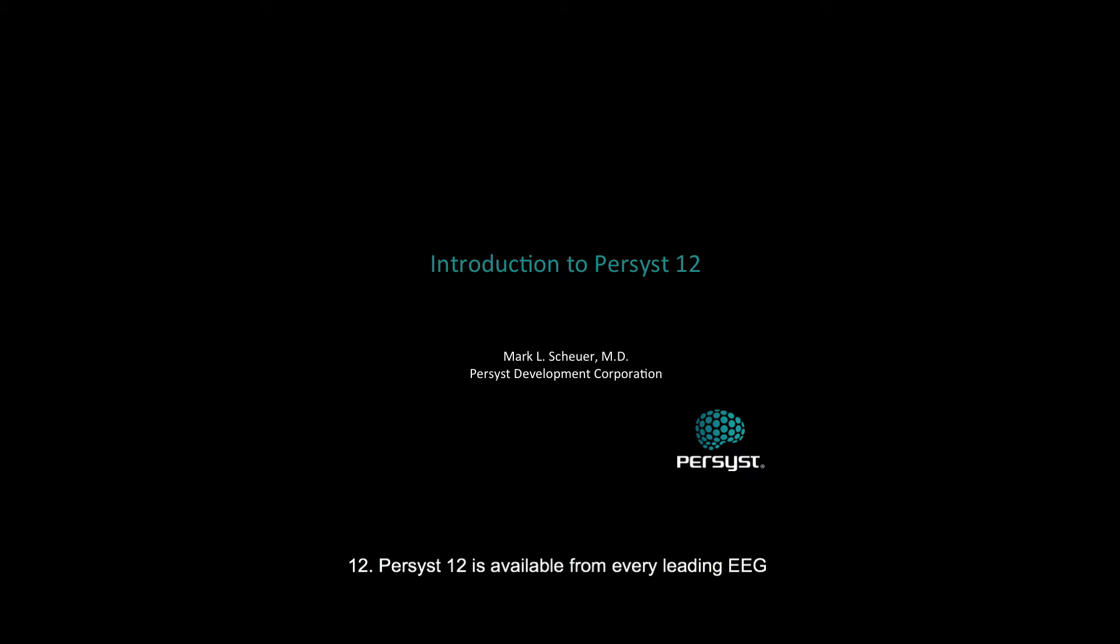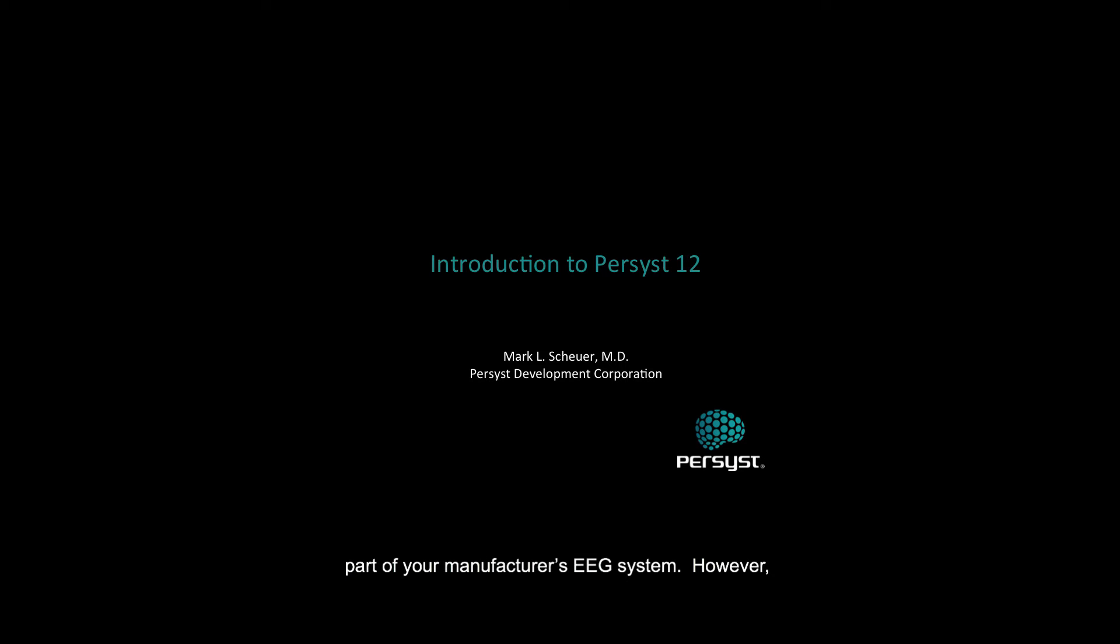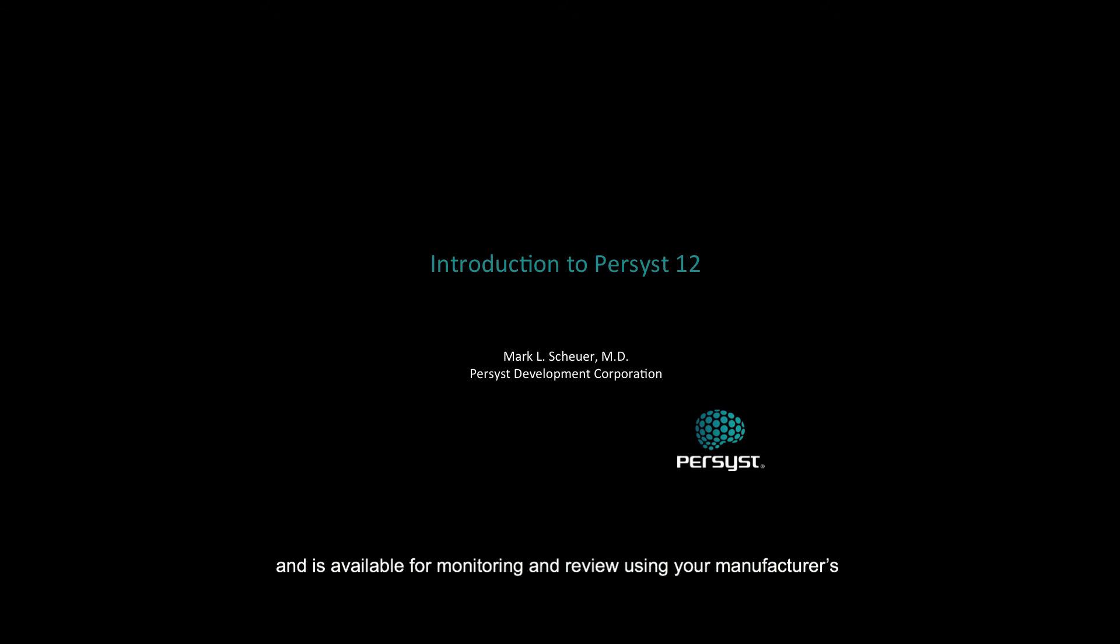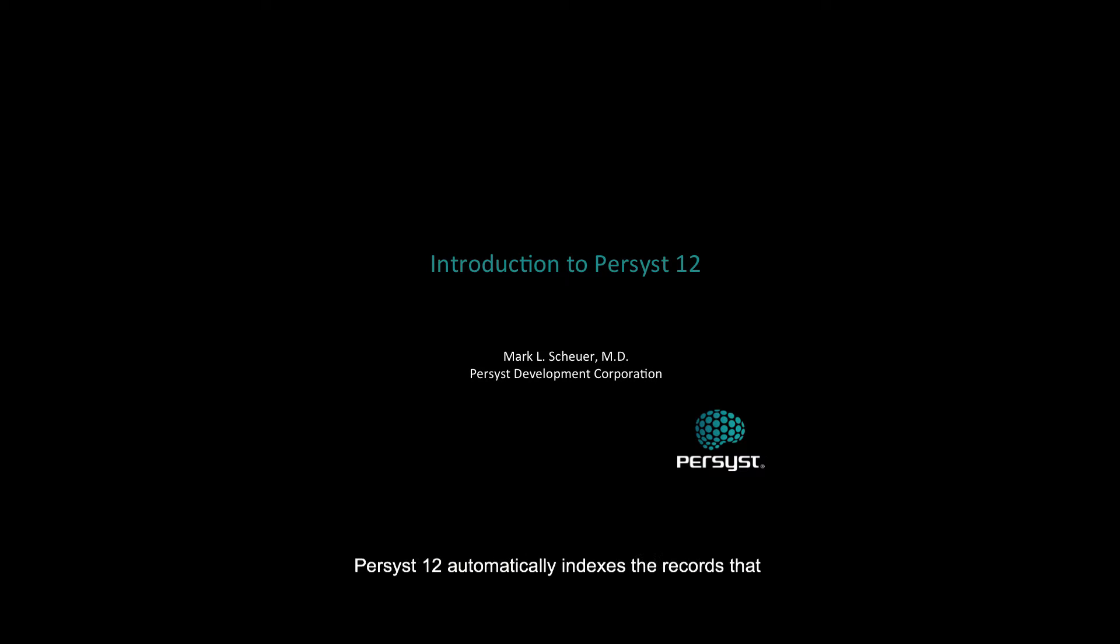Persyst 12 is available from every leading EEG manufacturer. Normally, you'd use Persyst 12 as an integrated part of your manufacturer's EEG system. However, since each system operates a little differently, in this video I'll be showing you the standalone version. When used in conjunction with your manufacturer's system, Persyst 12 analysis is performed automatically during acquisition and is available for monitoring and review using your manufacturer's standard database and review software.